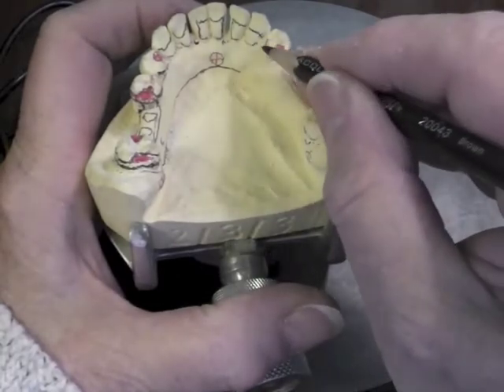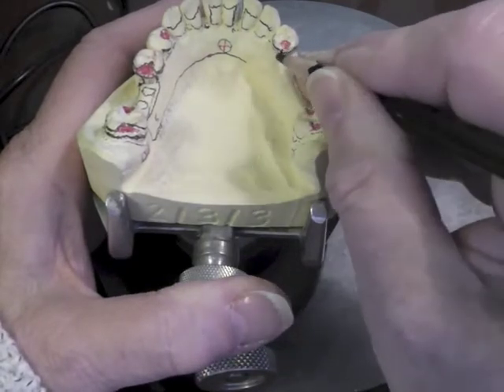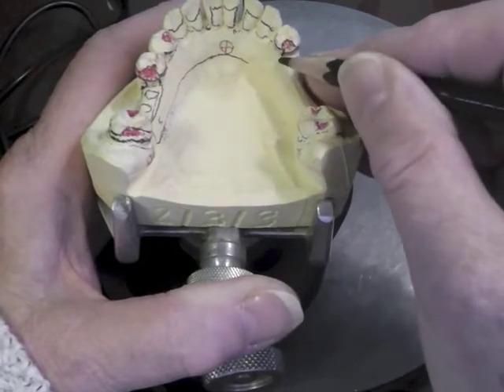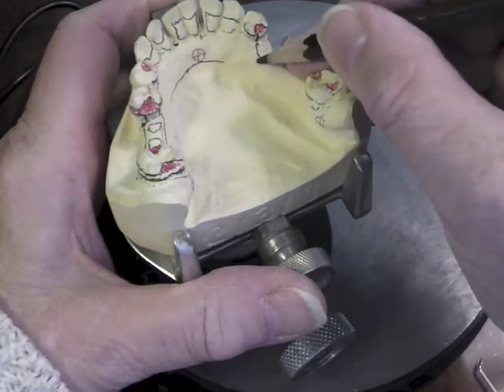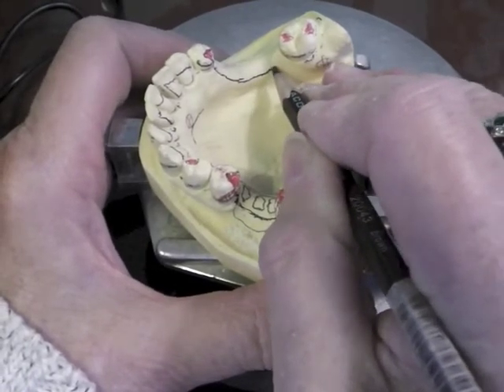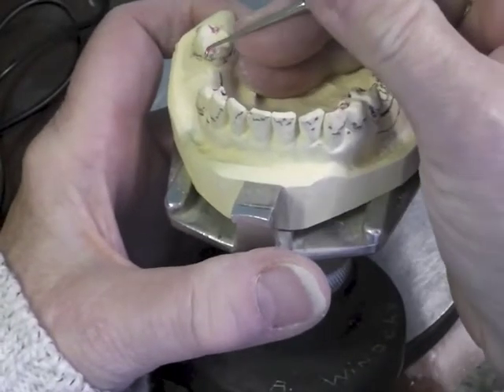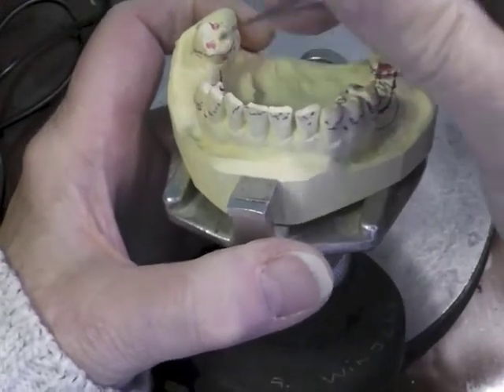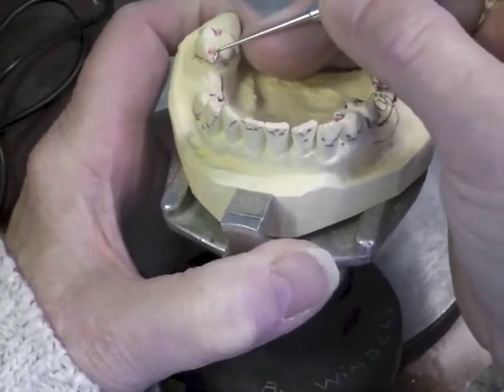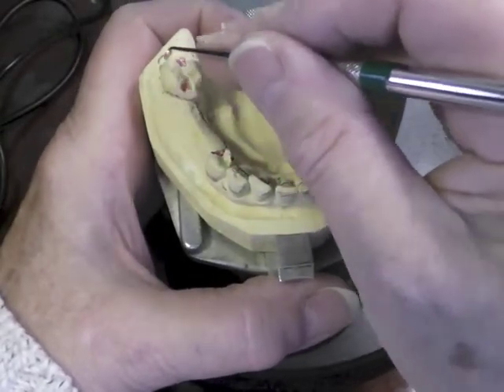I have my reciprocal component drawn here. I'm going to have base attachment along in this area, so I'm going to come down and come around my rest with the dark pencil. My finish line will come down here and come along. I want to put a tooth in at least the size of the missing tooth, and I'm going to come back up to this position. I have a high survey line on my molar, so the first thing would be to prepare my guide plate and my guiding plane. The guide plate usually is between the cusp tips. I'm going to have an arm coming in this direction, so I'd like a little bit of a sluiceway.